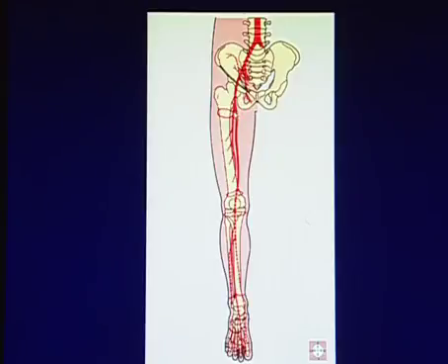Continuing further down, it bifurcates again. We'll look at the proximal portion of the profunda femoral artery, then scan all the way through the superficial femoral artery. Now you can see in this diagram, the line becomes dotted, and that just represents the fact that these vessels now are posterior to the bones displayed in the image. So coming behind the knee, the superficial femoral artery continues on down as the popliteal artery. The first large branch off the popliteal is the anterior tibial that comes between the tibia and the fibula and courses over to the anterior lateral compartment of the calf.